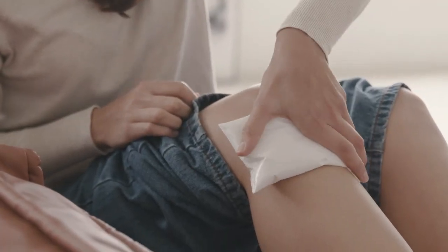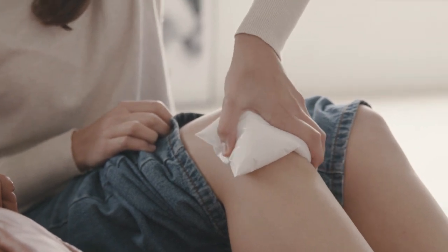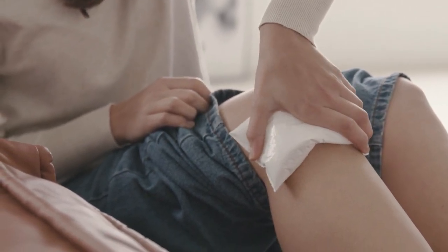Unfortunately, it's not always technically possible to perform a meniscal suture, so in some specific cases where there is a strong mechanical symptomatology or painful limitation for the function and the quality of life of the patient, it's worth to proceed with the surgery of removal of the torn piece of the meniscus. Now, let's give a direct look at how we perform this intervention with our surgical images.